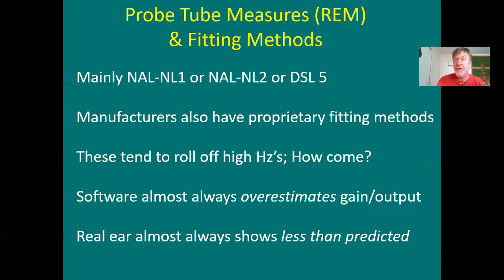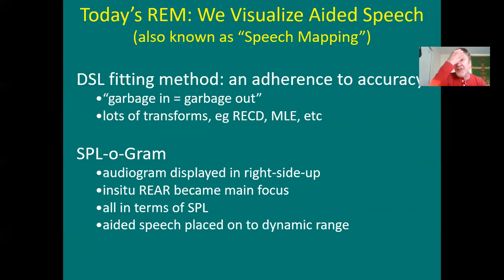They really aren't. Software almost always overestimates the gain and output, almost always paints a rosier picture than what you really get. Real ear almost always shows less than what's predicted. Today's real ear measurement, we visualize aided speech, and we call it speech mapping.